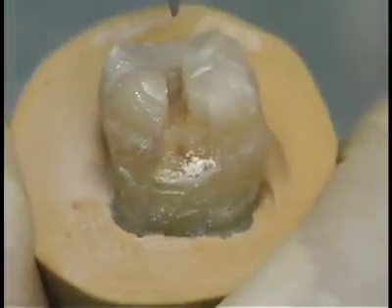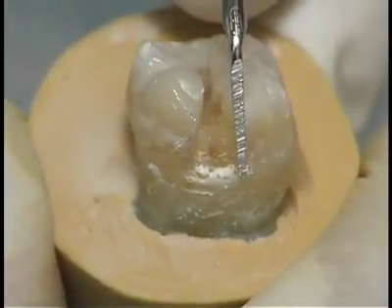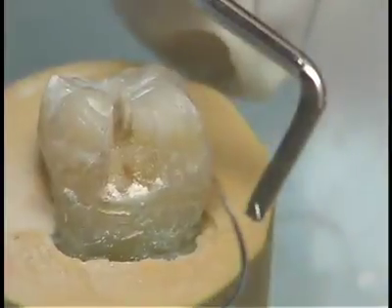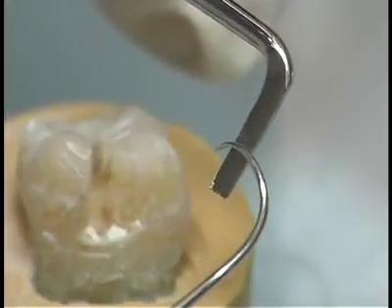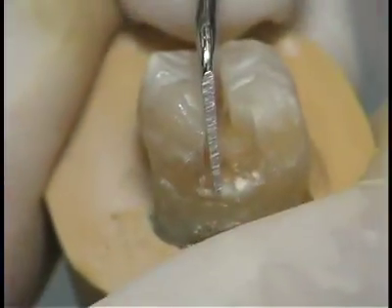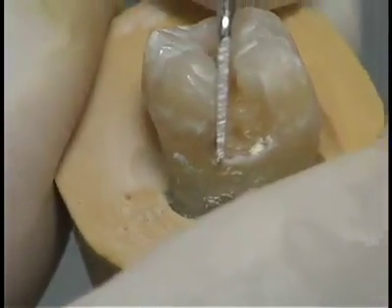Be sure the axial wall and gingival walls are smooth. Always use the instrument from the bevel side to the non-bevel side. Place the primary cutting edge against the gingival floor and the secondary cutting edge against the axial wall so everything can be done in one stroke. Turn the instrument around for the other side.